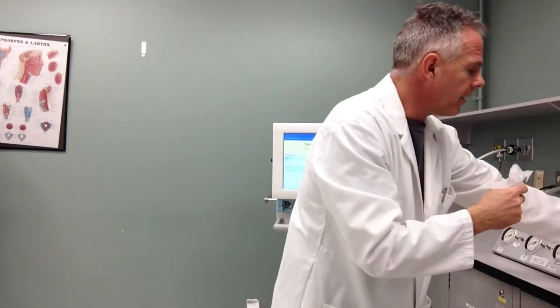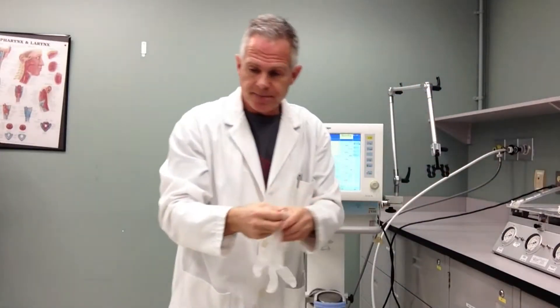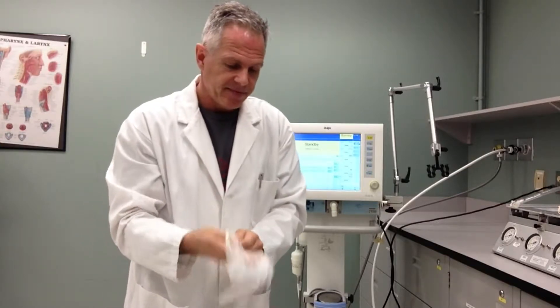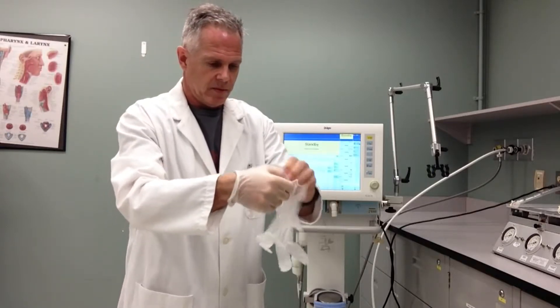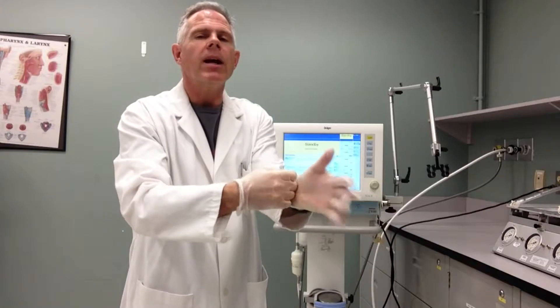My hands are clean, but I'm going to put on some gloves before I handle my clean circuit. Just getting some nice clean gloves here. Once we've got those gloves on, now I'm going to get ready to handle our circuit.